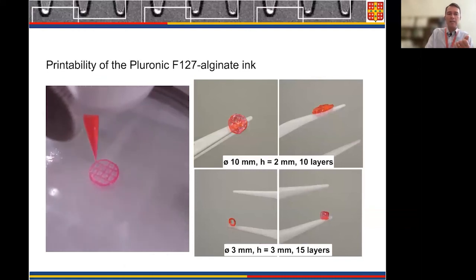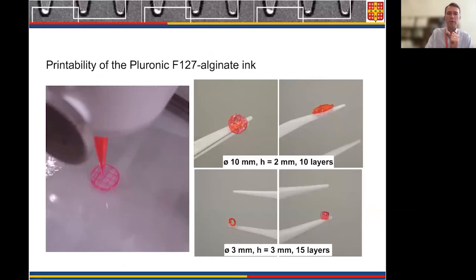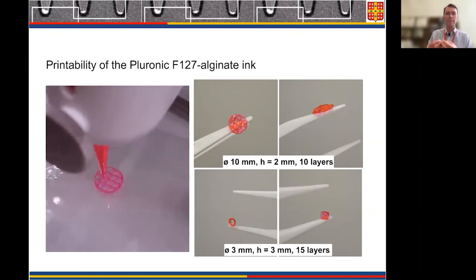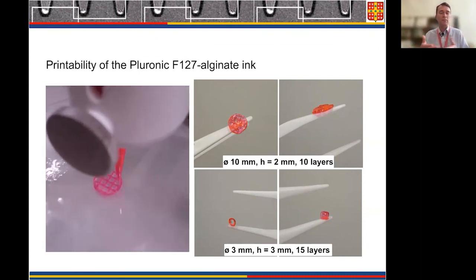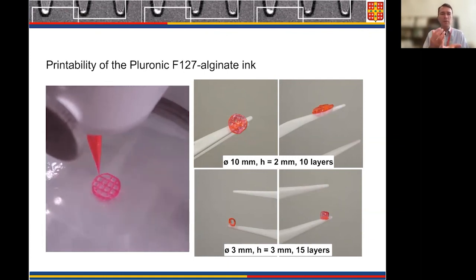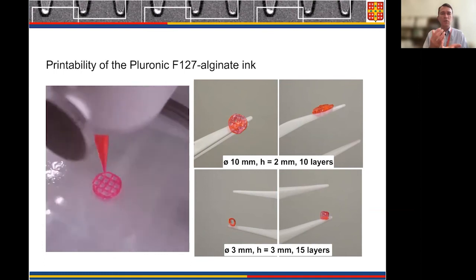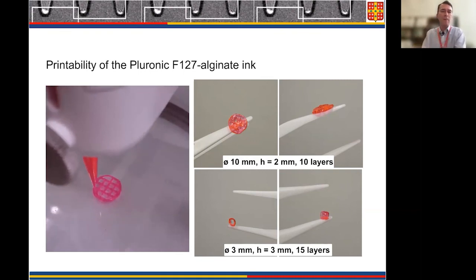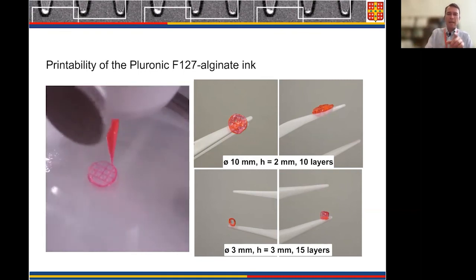And this is a demonstration of what we are doing at the moment. We are developing different types of shapes. So these hydrogels that contain gold nanoparticles are shaped in different geometries. And these geometries will be inserted in the small animal to mimic the gold nanoparticle elution therapies followed by radiotherapy.